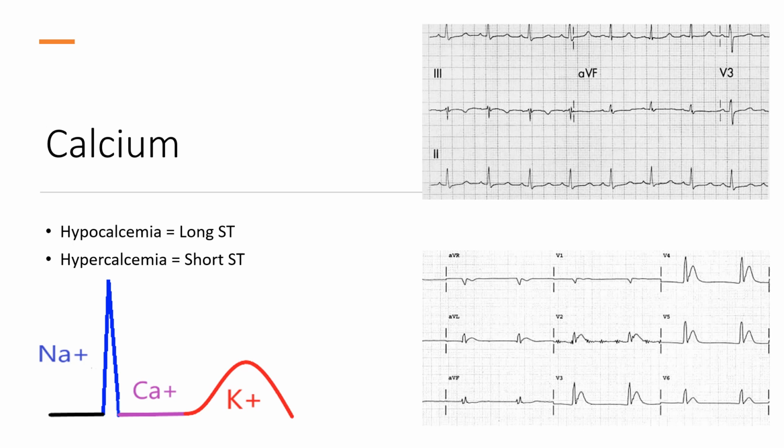One thing that I always felt like with hypercalcemia is it could maybe be mistaken as an early MI. If you're looking at V2 in this ECG here, you can see you got a big T wave. The T wave looks kind of symmetric, and it's right up on that QRS complex, which could mimic an early anterior MI. Of course, it would go to patient presentation.